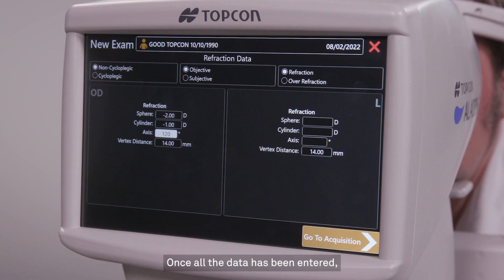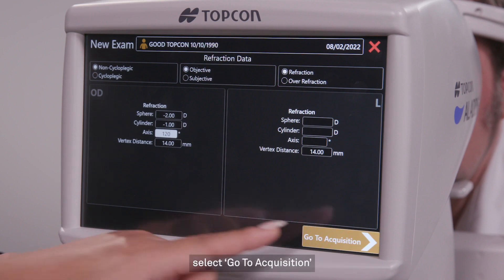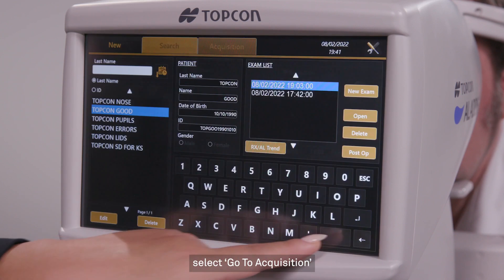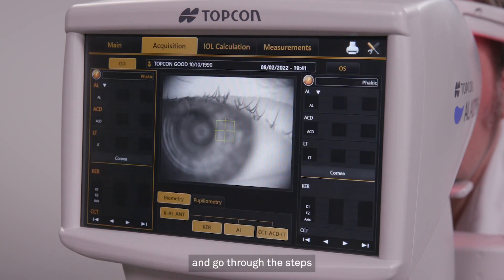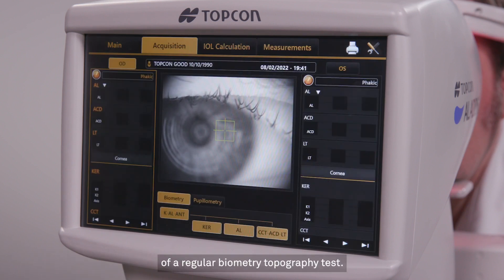Once all the data has been entered, select go to acquisition and go through the steps of a regular biometry topography test.